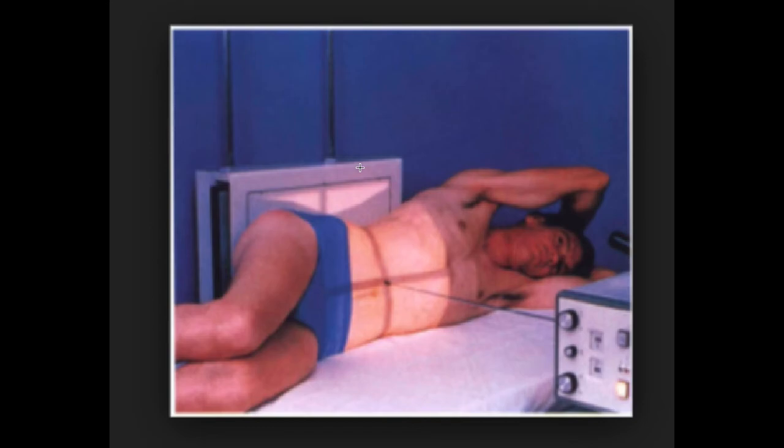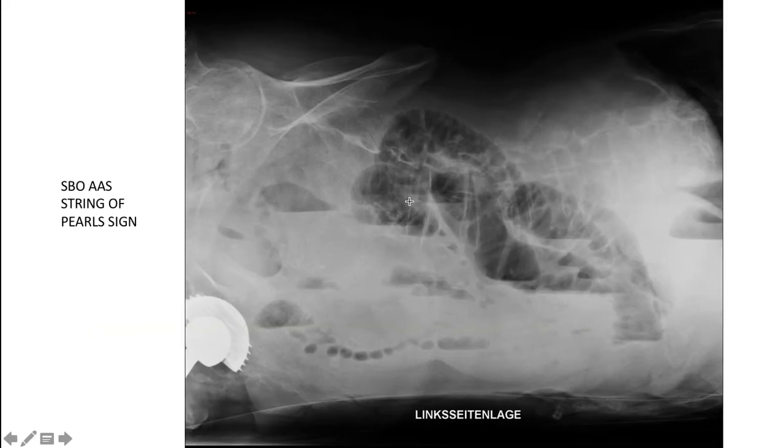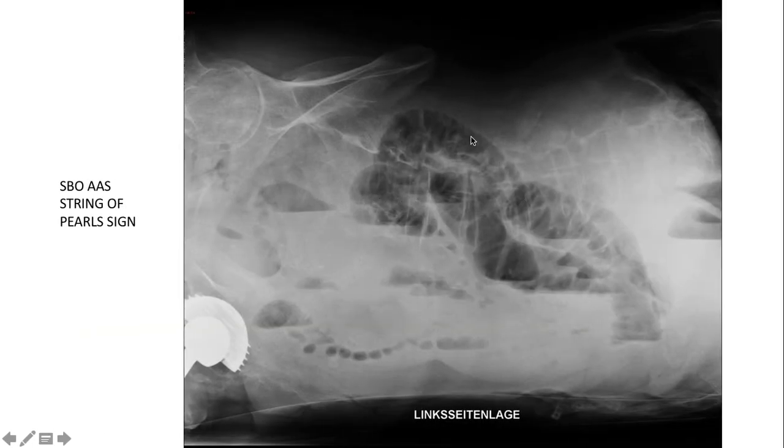What's the significance of a lateral decubitus? It's actually very significant and very important in checking the amount of air. Okay? Look at the patient position now. The gravitational force is acting right here, down to the floor. That means the air will escape upward right here. Now looking at the image that we just saw, look at the air. The air is up here.